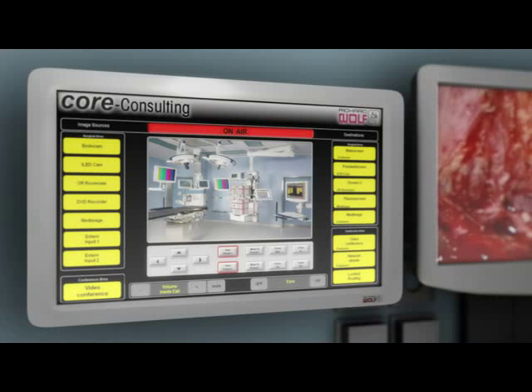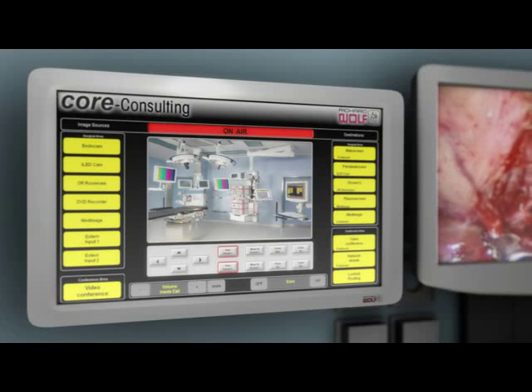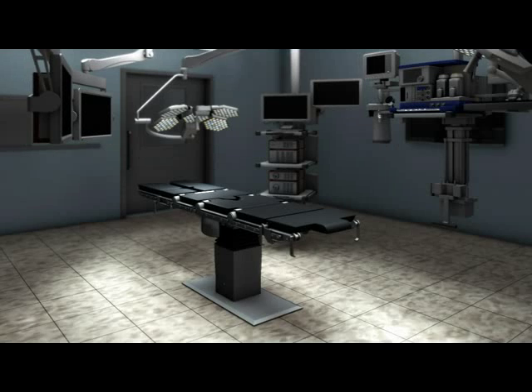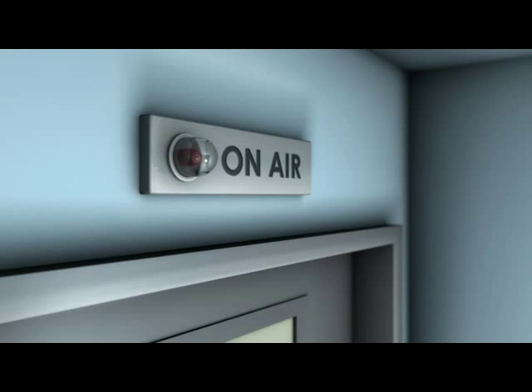Image distribution in the operating theatre and live stream and video conferencing can be controlled using this separate touchscreen monitor. This is also used to control different room functions, e.g. theatre lighting. And the visual displays indicate whenever a signal leaves the room.